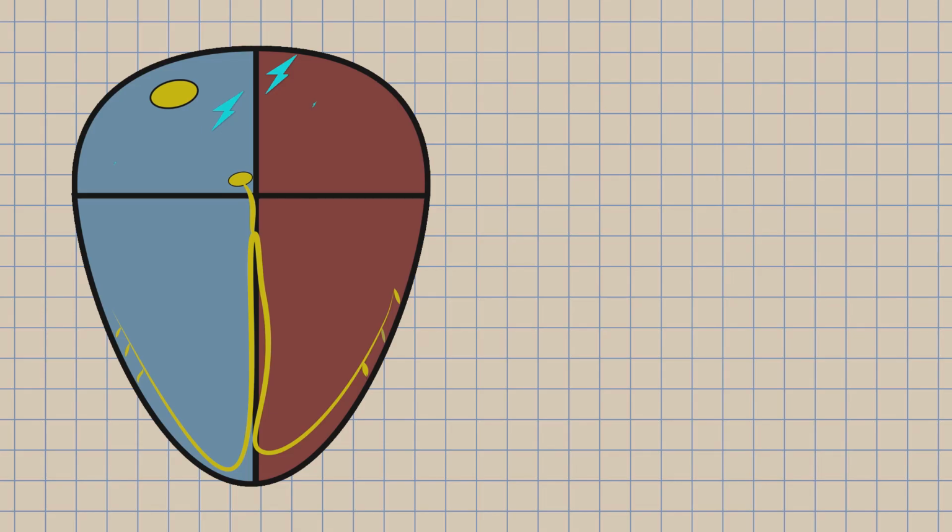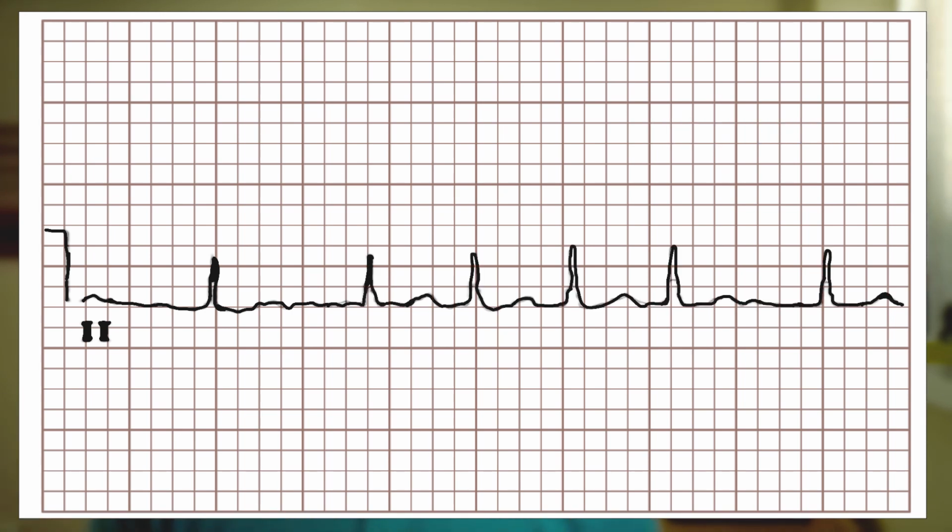Because this is not organized, the AV node only allows some of these impulses to go through it. So when this occurs, you are able to see a QRS complex on the ECG graph. Now, because of this haphazard discharge of electrical impulses, there is noise on the baseline. You cannot really distinguish any P wave because the foci are multiple. Multiple cells out here dancing, no organization. The QRS complexes are not regular because the AV node is not allowing the impulse of every focus to reach the ventricles. Else this would be madness.